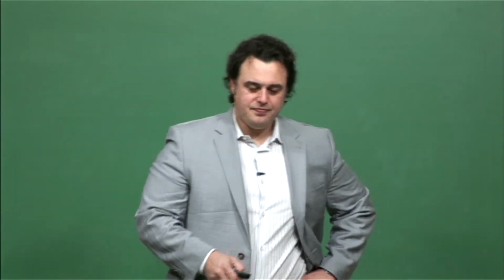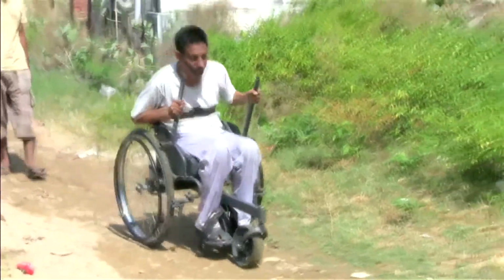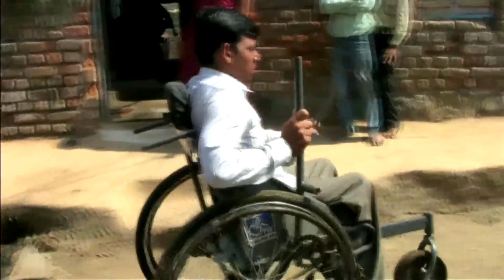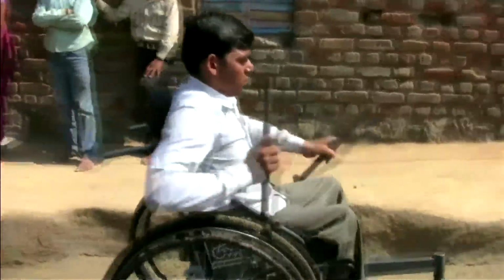So let's start with the LFC. So this is the Leverage Freedom Chair, and it's a wheelchair designed for conditions like this village in rural India with some rough terrain.